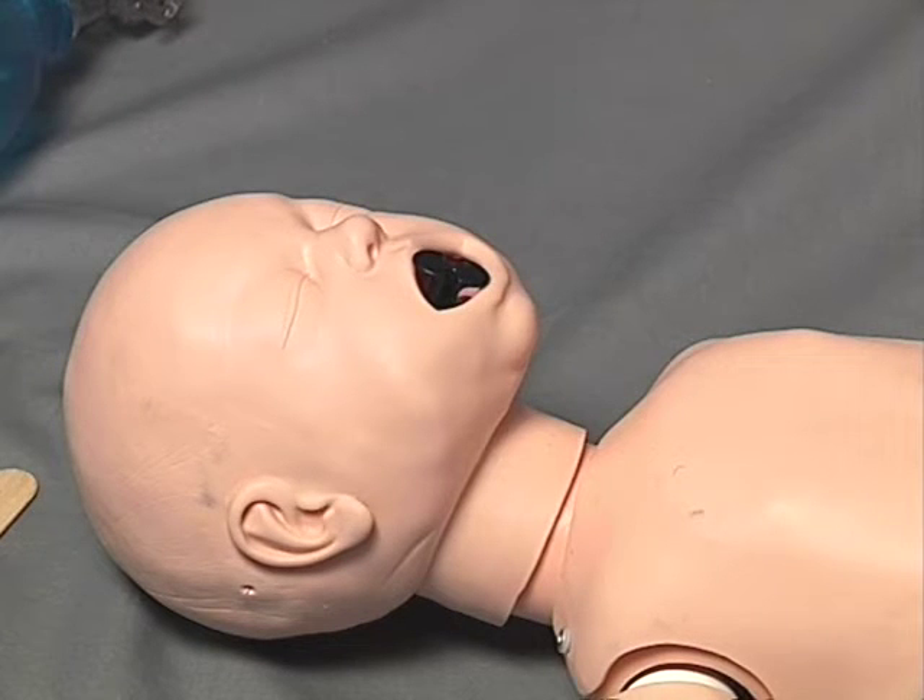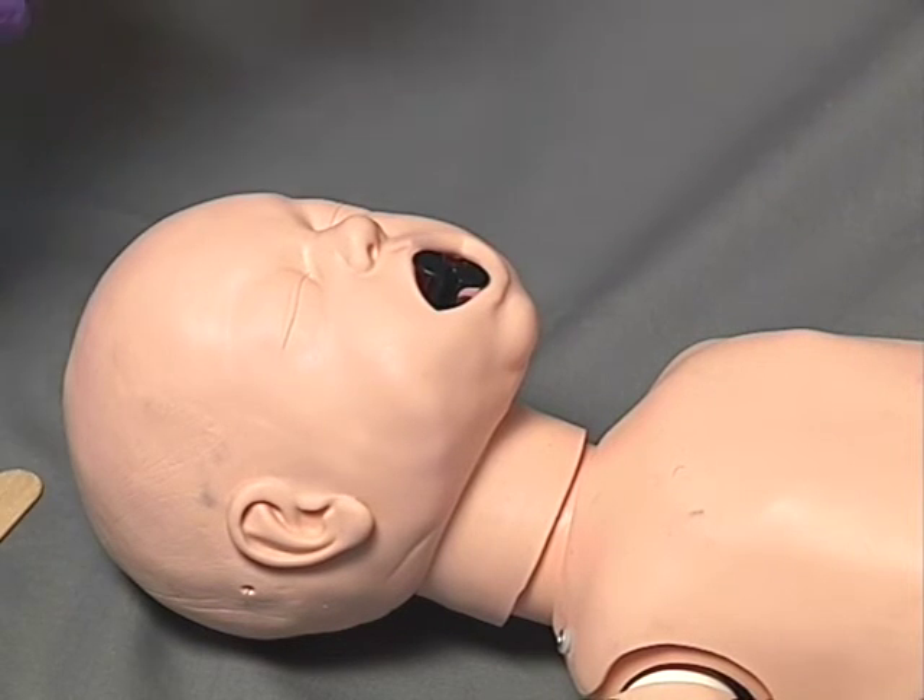Insert the oral airway in anatomical position so as to follow the normal curvature of the oropharynx until the flange rests against the lips or teeth. Lastly, check for adequate air exchange.